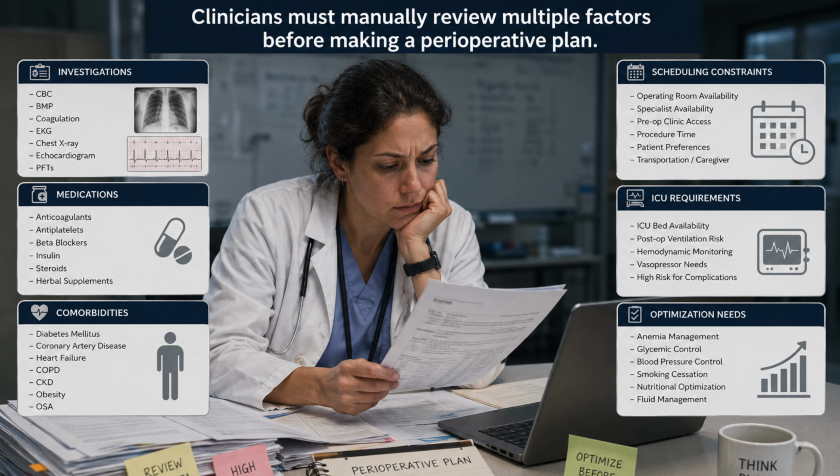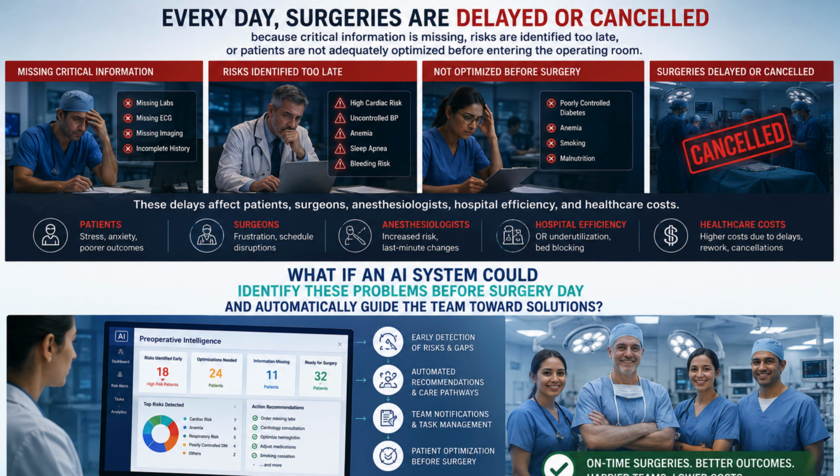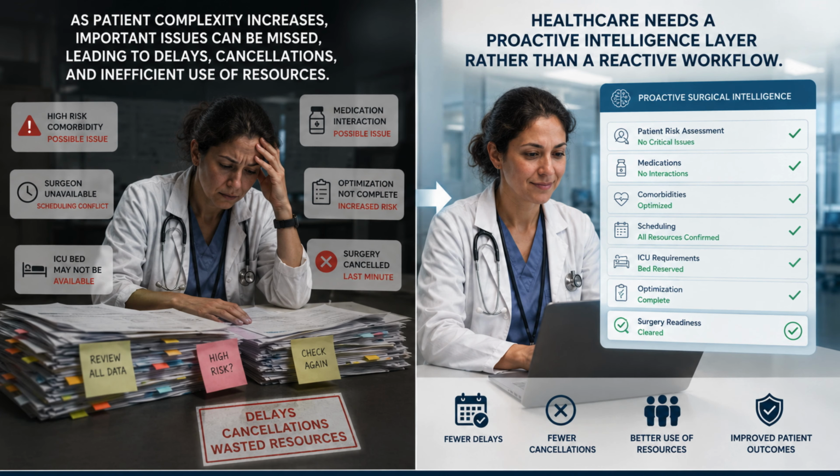Therefore, clinicians must manually review the investigations, medications, comorbidities, scheduling constraints, ICU requirements and optimization needs. As patient complexity increases, important issues can be missed, leading to delays, cancellations and inefficient use of resources. And these delays can often affect many people.